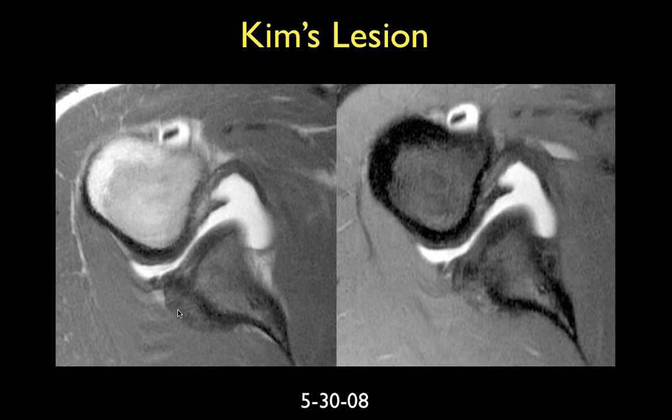Okay, I do see. It looks like the inferior portion of the labrum does not look normal. It looks irregular, like a piece of it is missing. So it could have been post-traumatic.